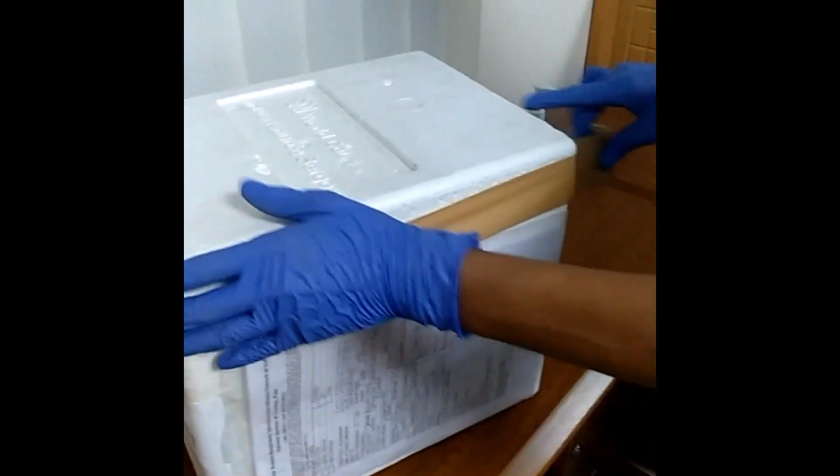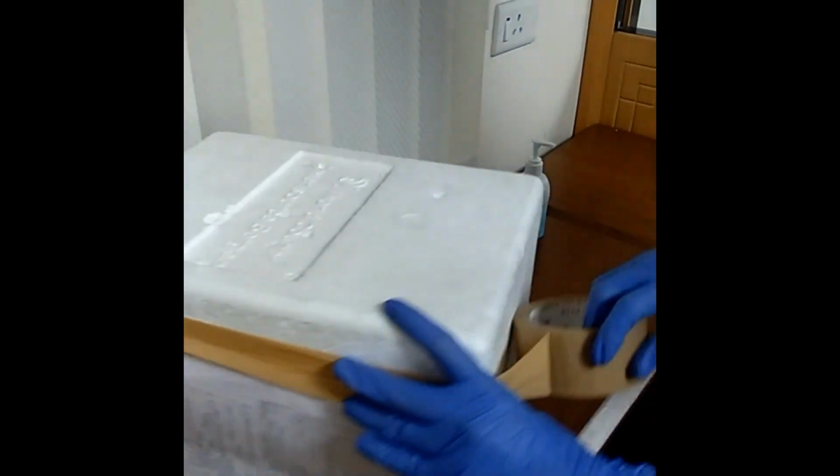At the end of sample collection, the sample containing box is properly sealed.